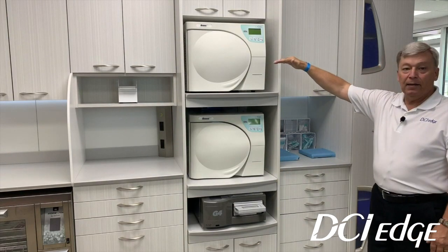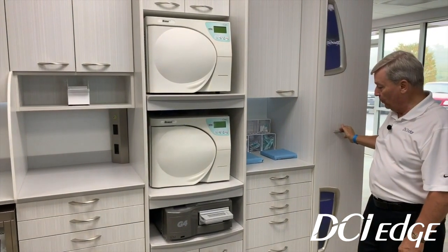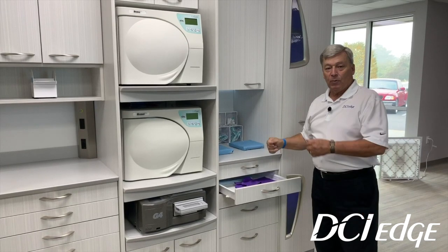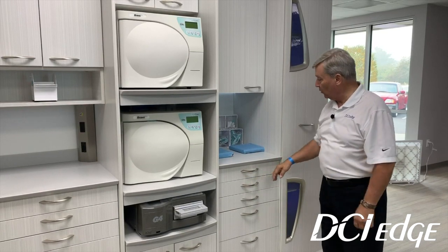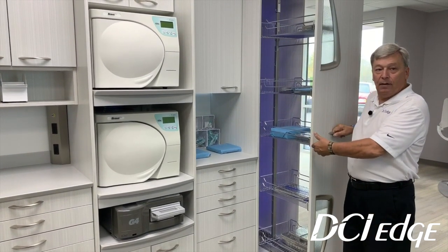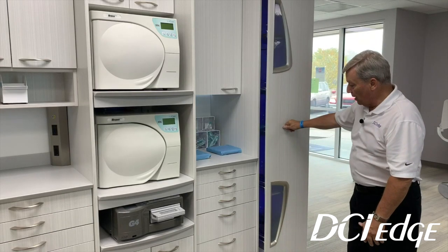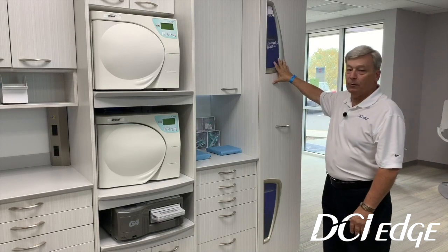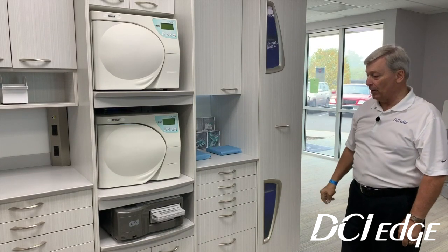Once your instruments, whether bagged, cassette, or however you're prepping them, come out, the last section would be sterile storage. You might use a drawer module and just keep all your surgery instruments in it, so you can take whatever forceps you need to a surgery case. The other module that we have is a slide-out module that you can stack cassettes, trays, bags, whatever you'd like into. And again, this can be tailored for the office. This particular model has the blue lights, which basically means sterile. At the beginning, we saw the red lights, which stand for dirty or contaminated.